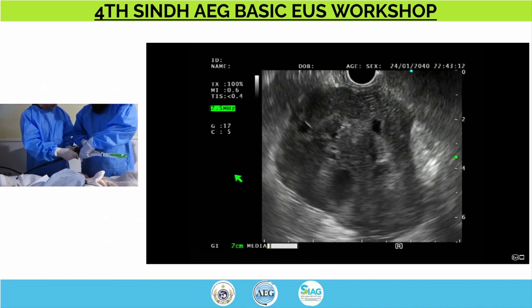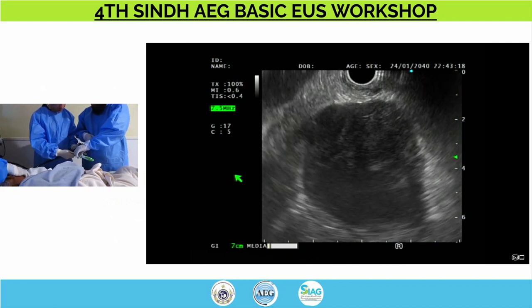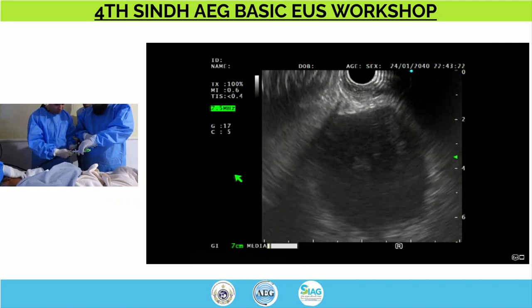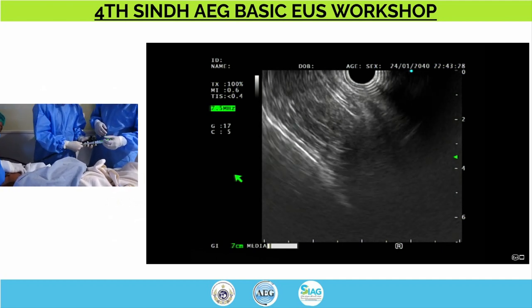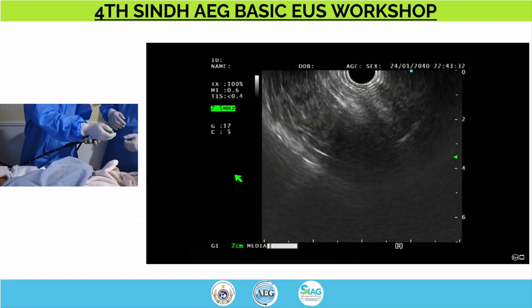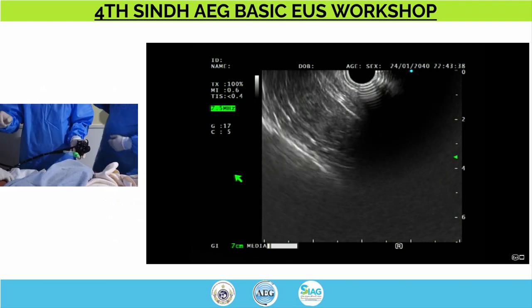This is also a very vascular lesion. So could there be a vessel in there? Yes. But there are so many of those cystic areas, so that really indicates cystic change rather than a vessel. But could one of them be a vessel? Yes, it could be.